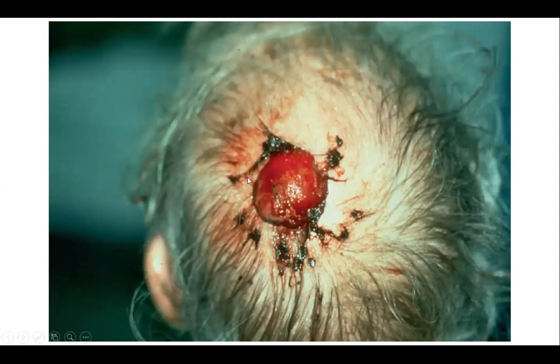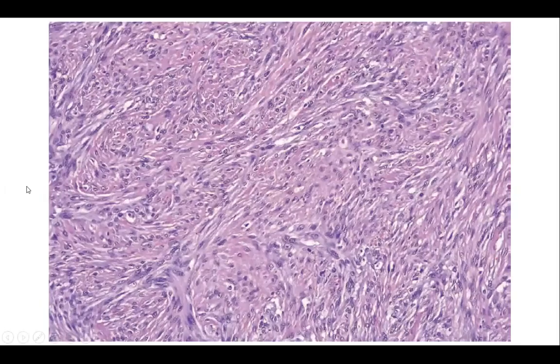So this is basically a histology diagnosis, but you can see here an ulcerated nodule in the scalp of an older person. And this is what you see on histology. So what would your differential diagnosis be here?